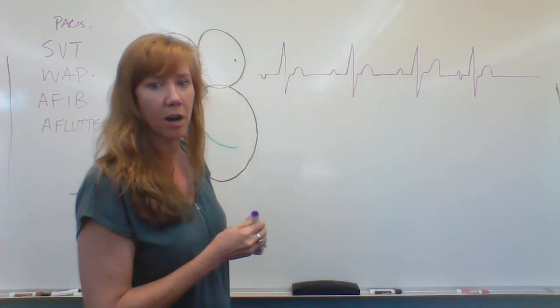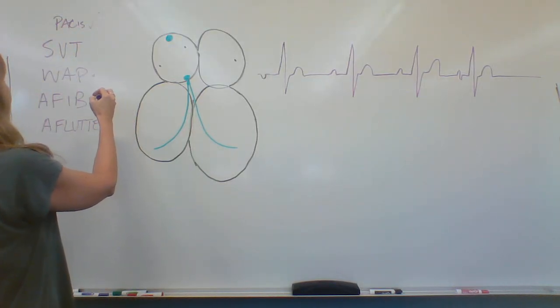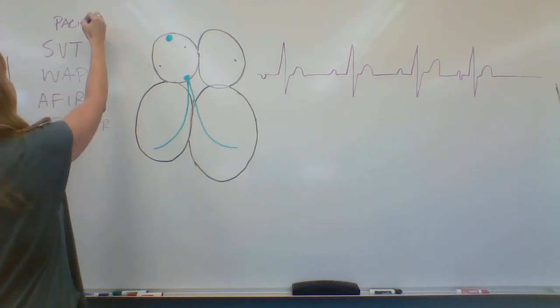All right, moving on. Let's talk about SVT. Now we're getting into the big stuff.